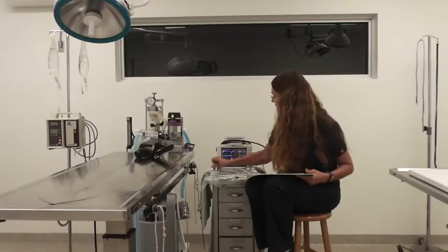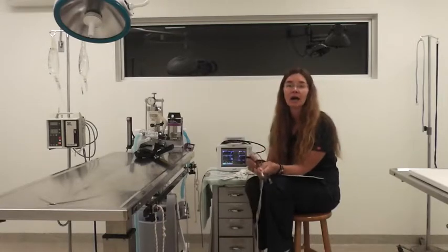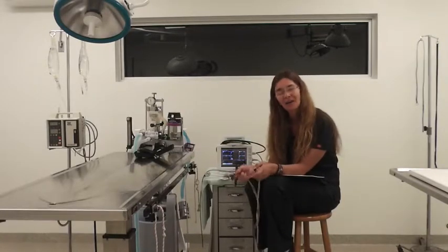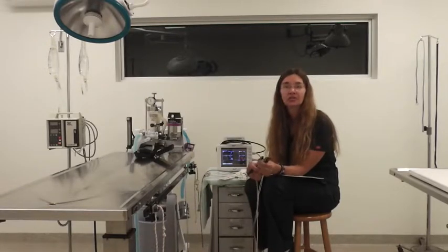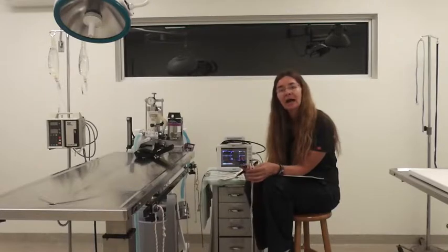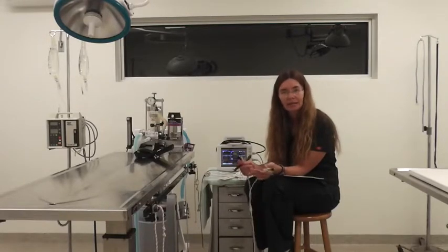Also using the ECGs, we are looking for a P wave for every QRS complex. So that would tell us if something was going on different too. So using your stethoscope, using these things can give us a good idea of how the heart is pumping, if it's a good steady rate, beating correctly.